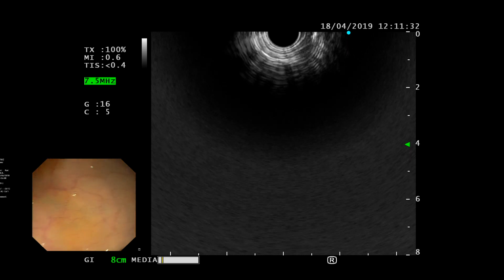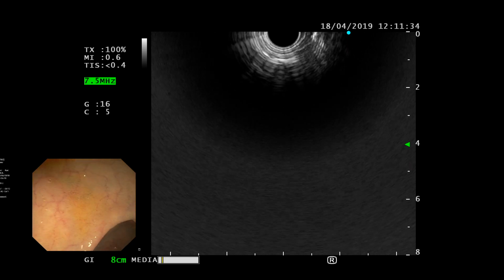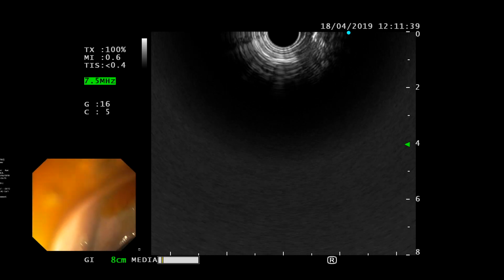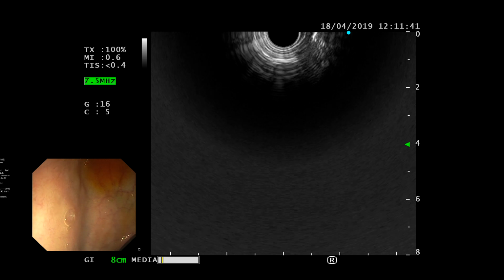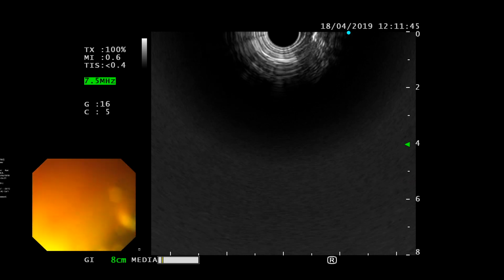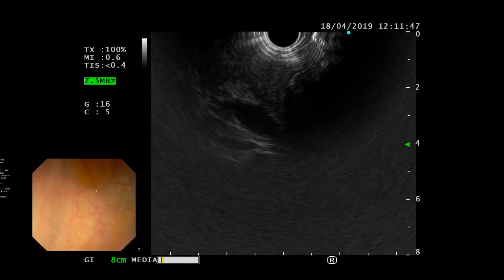There. Now stop. Okay. Now drop your left hand away from you towards the floor. Because you want to get this wall, suction. You want to go up. You want this. Yeah. This. Left of screen. So don't pull back too much or you'll come back in this. Right there. Suction.